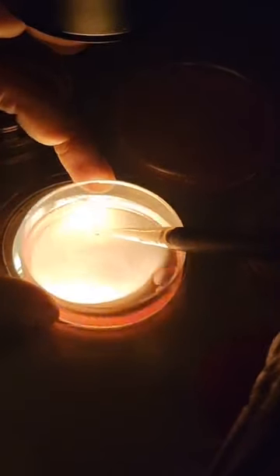The antral follicle count in the luteal phase is the basic information you can gather to know how many AFCs you can stimulate. Our first goal is luteal phase stimulation. You can see this is the OCC complex beautifully visible here — this is with the camera zoomed in. We will aspirate it and put it into another dish where there is another OCC complex.